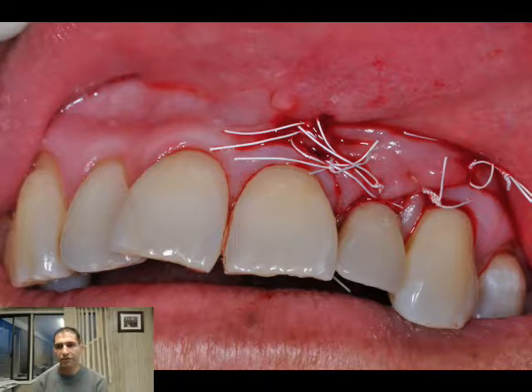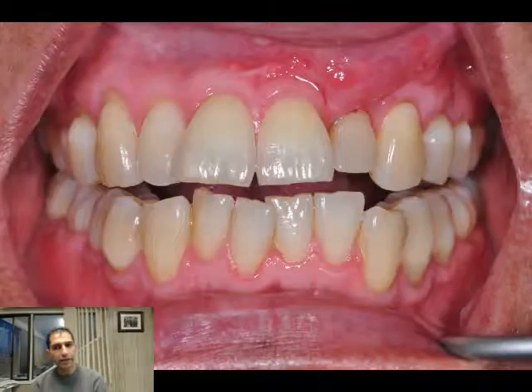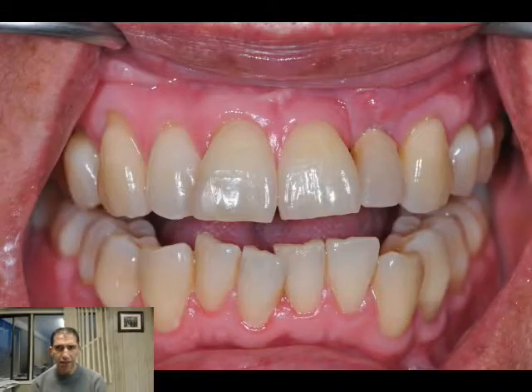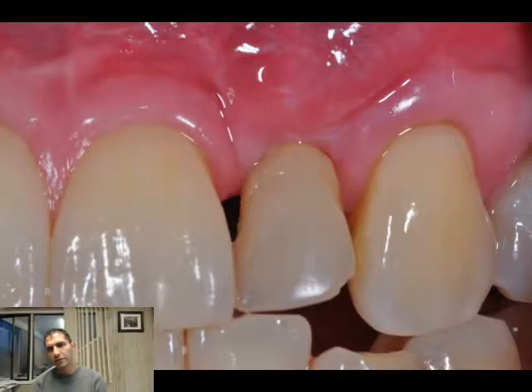These are pictures of the provisional in place. There is going to be no loading — this is a very important point. This is immediate placement and immediate provisionalization, but no loading. You can appreciate the healing here.